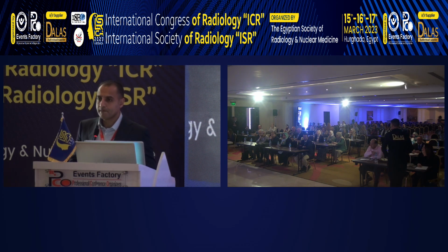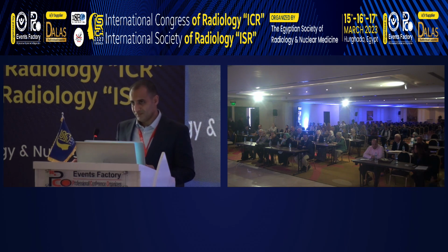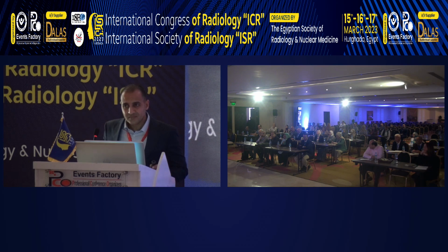Thank you, Dr. Omar, for your presentation. But I have a question about the contrast in adhesive capsulitis. As we know, the frozen shoulder we confront is in stage 4, in which there is fibrosis. What's the benefit of contrast in such stages? No synovitis, so there will be no enhancement.